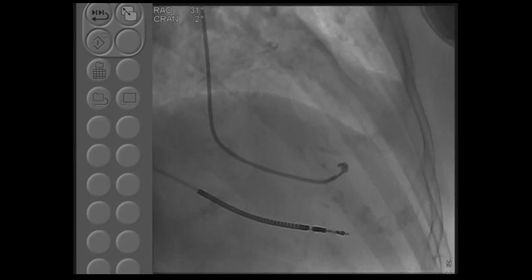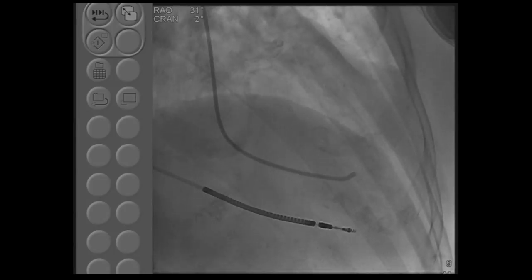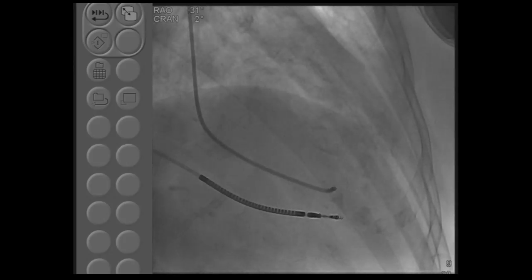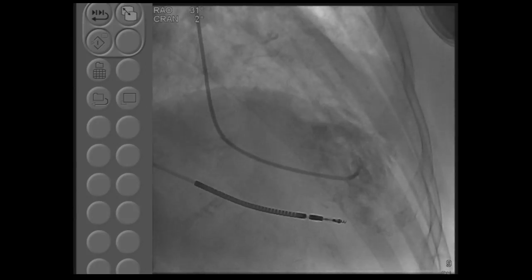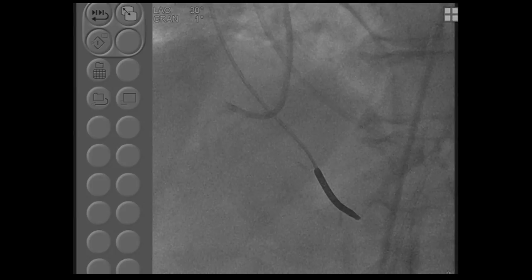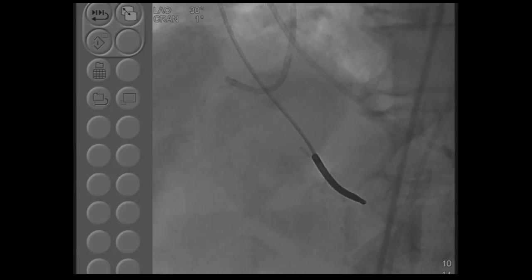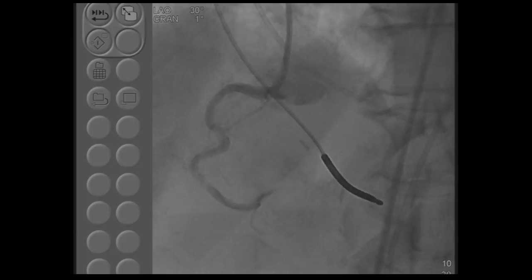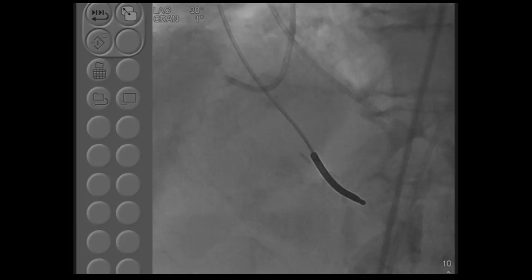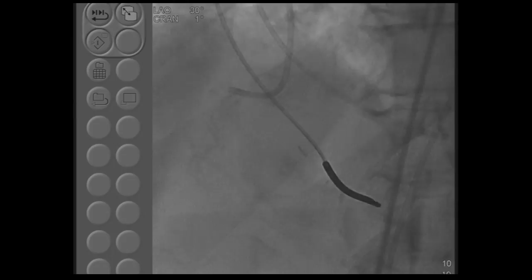And this is her EDP. She's on Lasix and other good medical therapy for her LV dysfunction. EDP today is 12, but she has LV dysfunction with the EF ranging about 25% or so, most of the dysfunction in the anteroapex and inferobasal area. This is the right coronary artery, with moderate calcium and tortuosity in the proximal part. Just after the RV branch you have significant disease, about 15 millimeters of eccentric calcific disease, just at the angle.